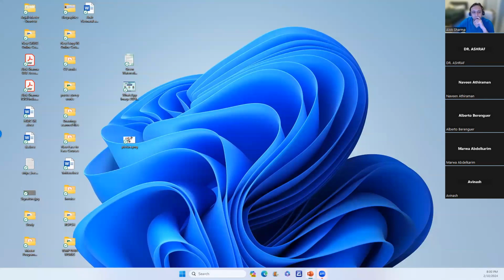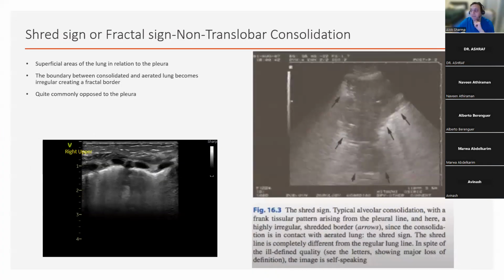The transition from type 0 to type 3, how long does it take? That's a lovely question. Blank's article says that you can actually have it in 10 minutes. So it may take 10 minutes for you to move from stage 0 to stage 3.